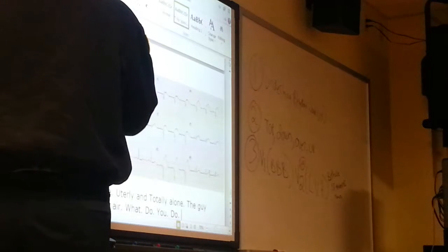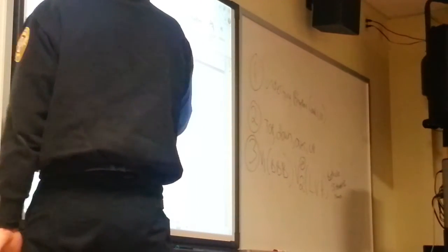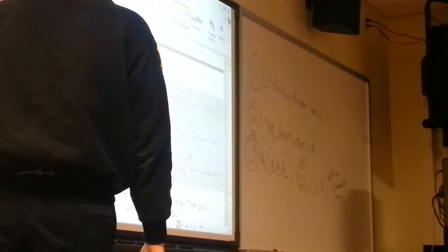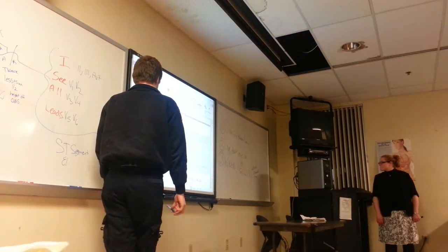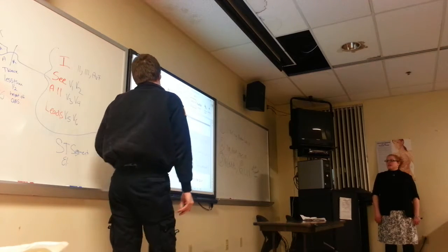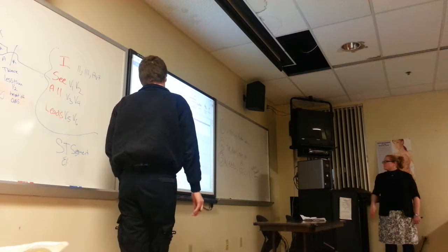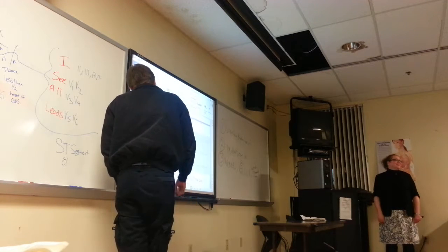Everybody. And show me where lead two ends. Here. Over a little. Yeah, there you go. Okay, cool. Any issues in lead two? It's a little better, but the T-wave is still quickly eclipsing the P, which is not good. Well, the T-wave can be bigger than the P, that's okay. It's gihugic in one, but it's not as gihugic in lead two. Yeah, I agree. Okay, lead three. Gihugic.